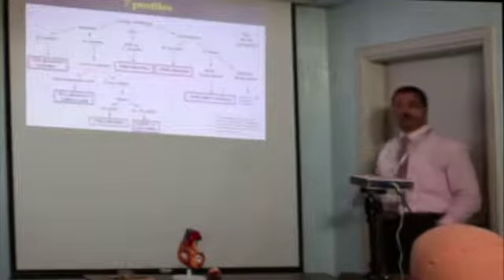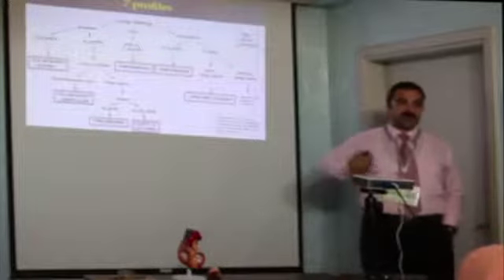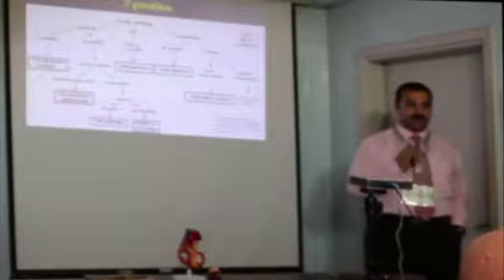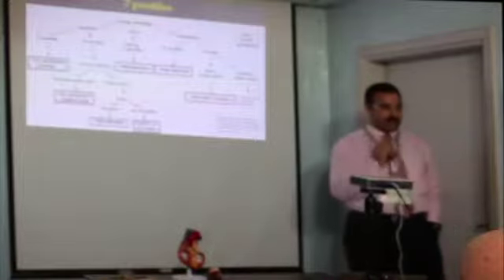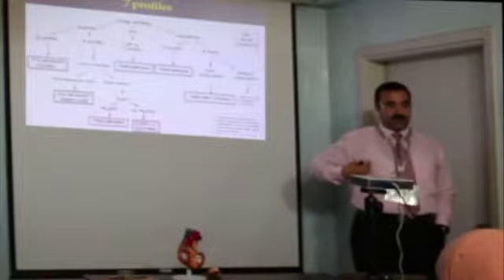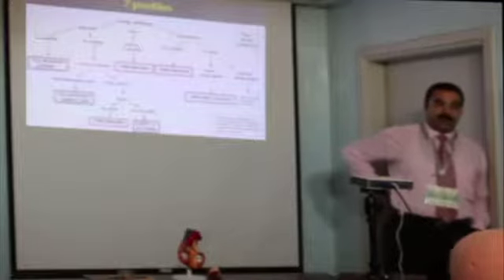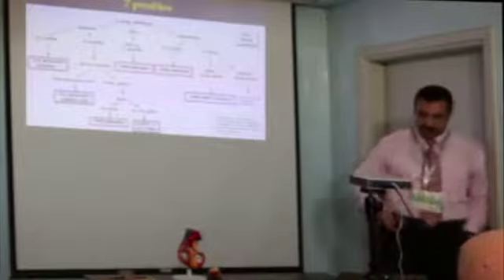How to confirm that? Lung point. If you find the transition zone between the stratosphere, the barcode, and the seashore, if you find this point, it is 100% pneumothorax, very specific. Provided you find the lung point, you will spend some time doing that because you don't know where the area of transition is. So we go first BLUE point, second BLUE point, PLAPS, three areas. Plus, if you need more, you can go to the diaphragm. If it's a weaning failure, we'll teach that also.